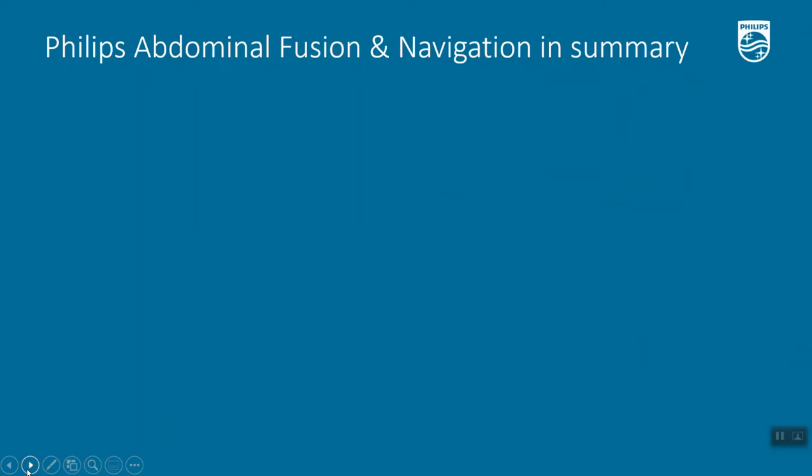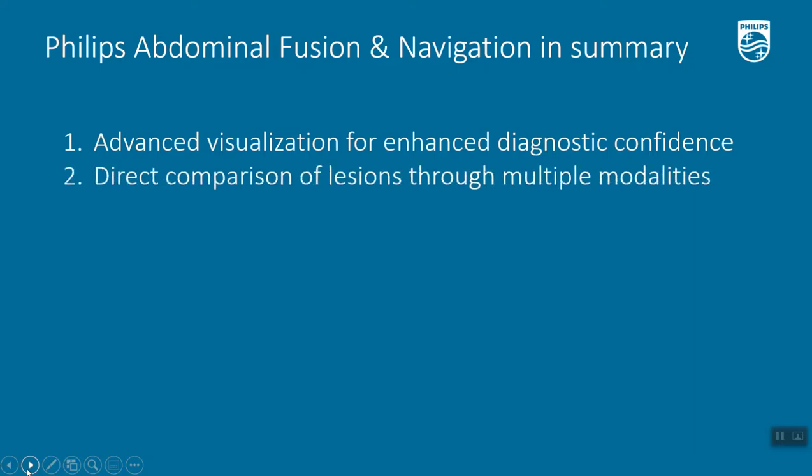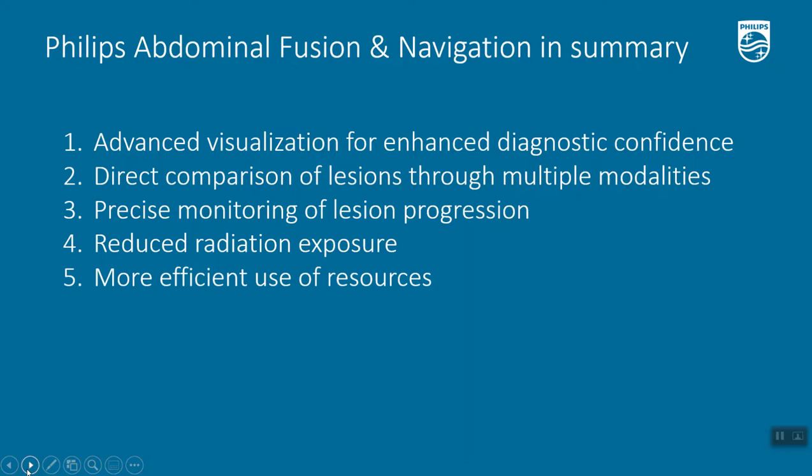So to summarize, the benefits of fusion and navigation for abdominal application are as follows. It can help in advanced visualization for enhanced diagnostic confidence. You can compare the lesions through multimodalities. You can monitor the lesion progression. It helps to reduce the radiation exposure and contributes to more efficient use of resources.